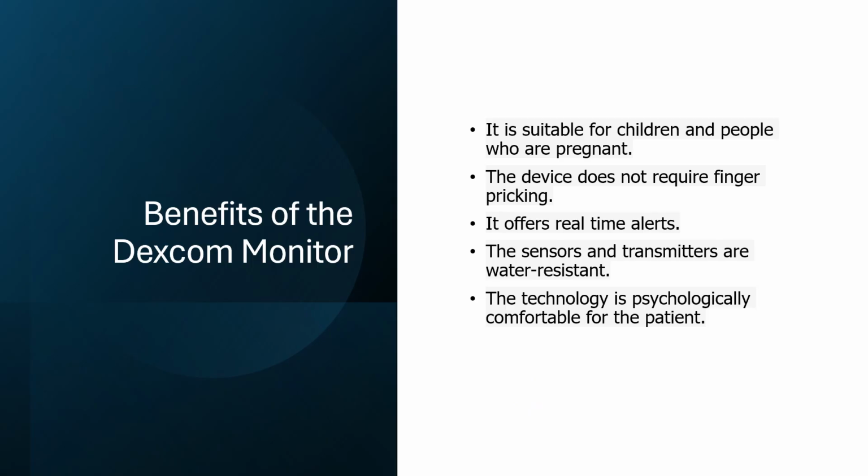In the contemporary era, where people are diagnosed with lifestyle diseases, diabetes has become the most common. Since many people are diagnosed with the condition, Dexcom Glucose Monitor is a technology that helps diabetic patients be updated on their glucose levels to help them make appropriate decisions in the form of diet or engaging in exercise. Although technology has been crucial in presenting real-time patient monitoring as a benefit, it does attract concerns regarding its safety among its stakeholders.